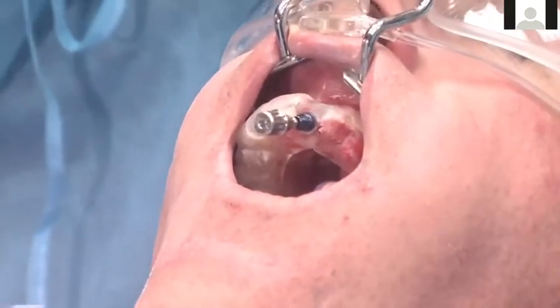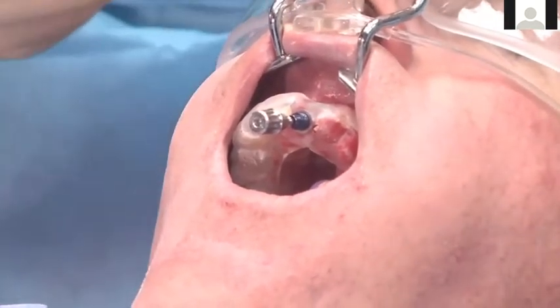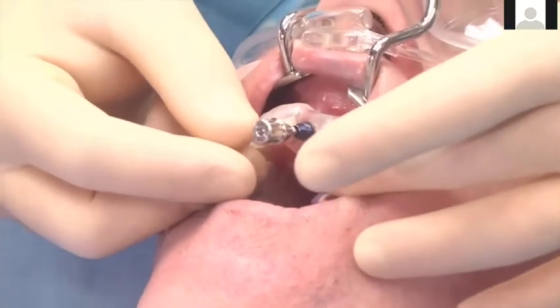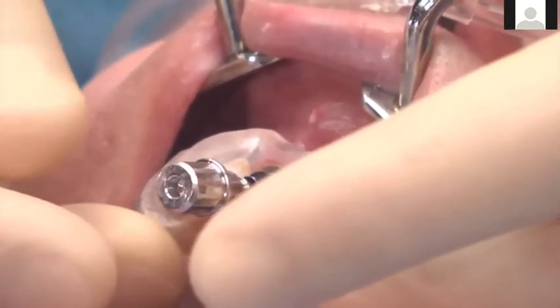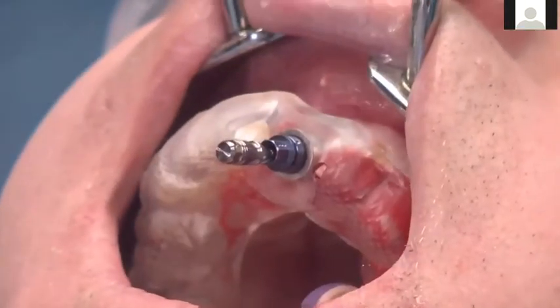Now at this stage, once the guided mount is off, obviously as previously stated in our plan, we wanted to go ahead and place a custom tissue former here that we would do with a CEREC. Now, if your implant does not achieve enough primary stability, please do not try to put a custom tissue former on it. Just put a smaller healing cap and let it heal undisturbed.